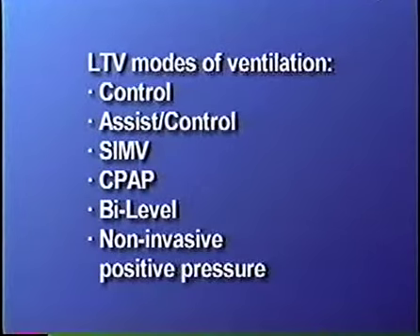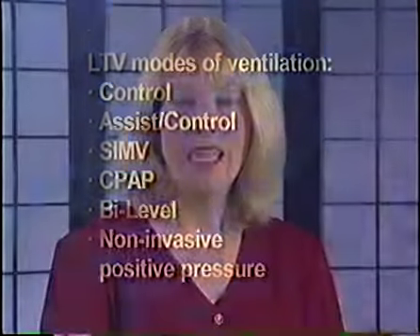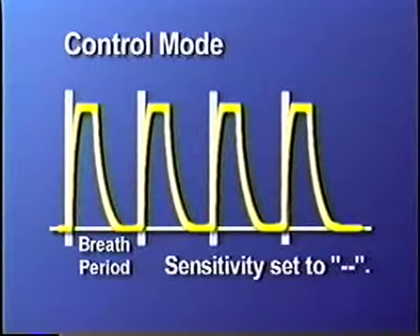The LTV can provide the following modes of ventilation: control, assist control, SIMV, CPAP, bilevel, and non-invasive positive pressure ventilation. It also has an apnea backup mode. Let's look at control ventilation first. In the control mode, volume or pressure control breaths are given at the rate specified by the breath rate setting. No patient-triggered breaths are allowed.